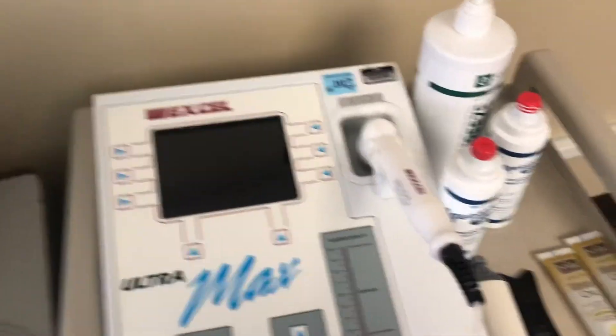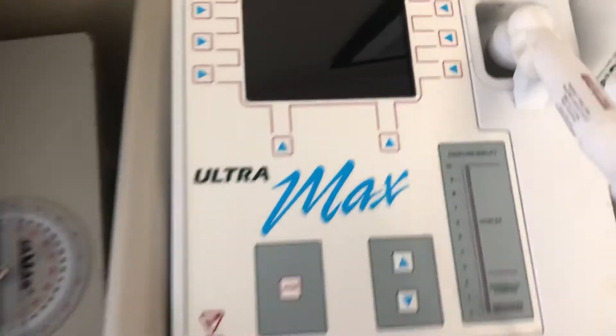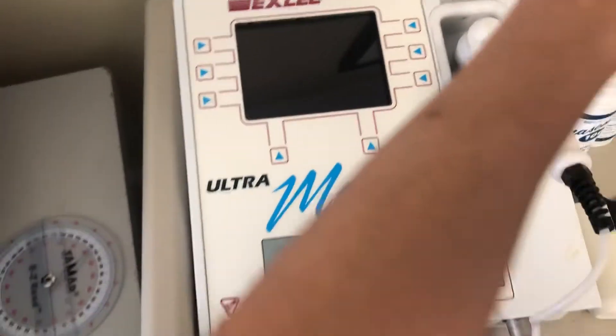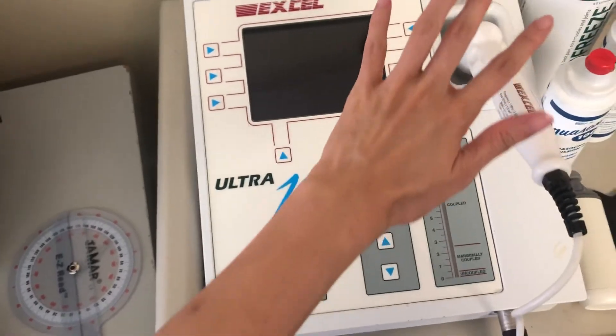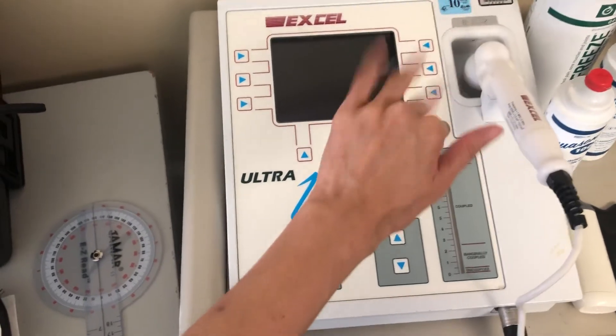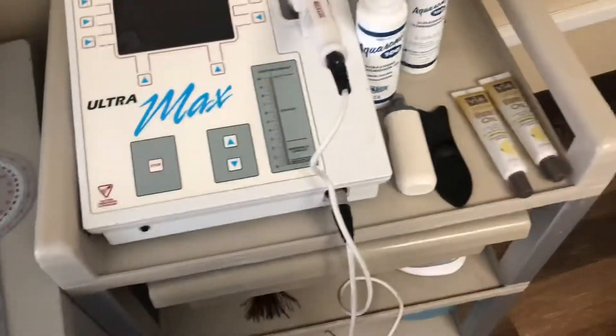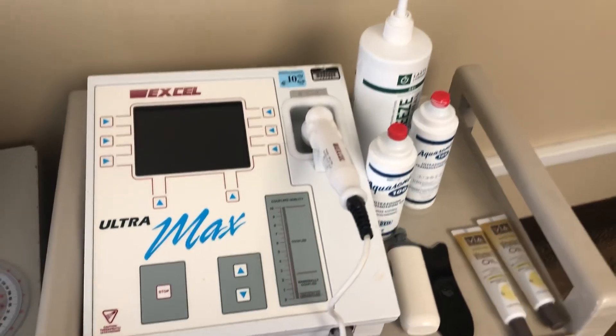This is the TENS unit, which is electrical stimulation. You put it on the affected area to increase circulation of the blood, get your arm a little less stiff, and it's supposed to help with pain as well.